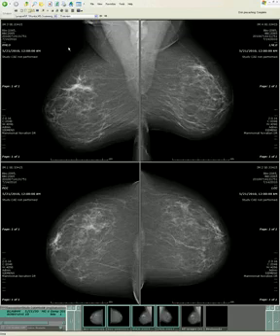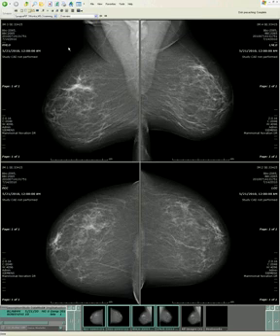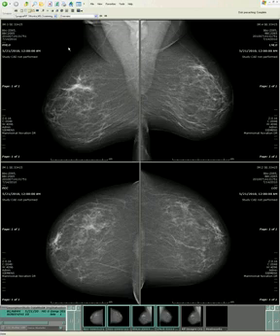The other findings when we're looking at screening mammography, besides masses and calcifications, are sometimes more subtle. But these are just as real and just as dangerous. So as we evaluate the mammogram, we're looking for areas of asymmetry. Even in these relatively fatty breasts, we can see that there are some differences in density which may turn out to be due to cancer.